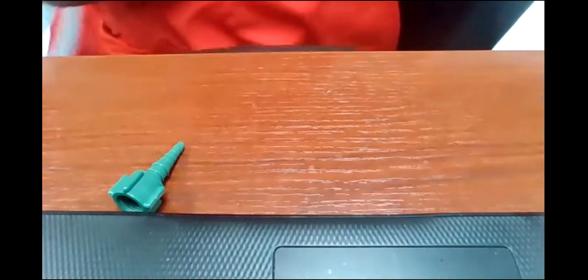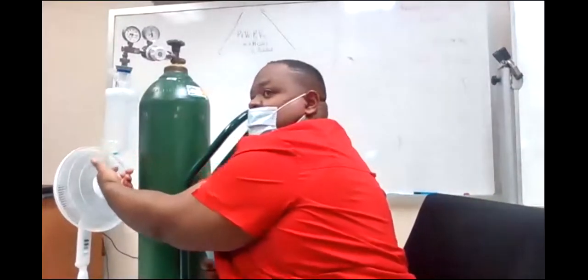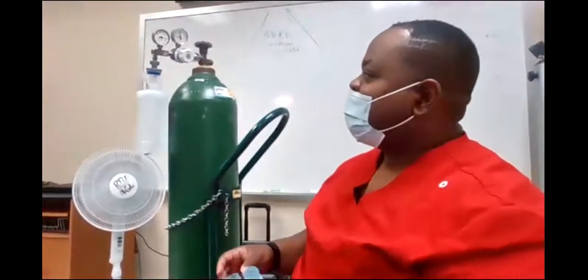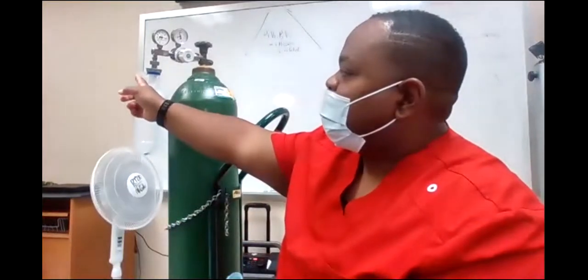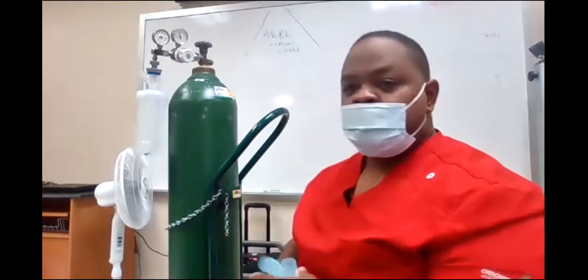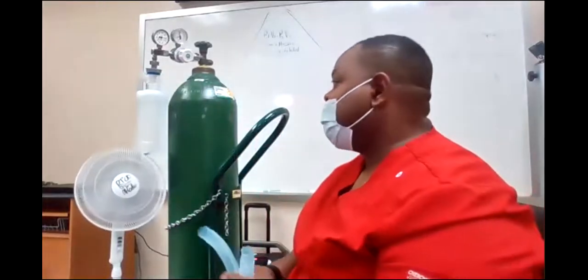See that? You might not can see it at home, but you see that coming out of there? You don't see that mist shooting out of there? You gotta kind of look at something dark behind it. See it? That's aerosol coming out of there. If you can't see it at home, this is aerosol coming. It's like a little fine smoke coming out of there, okay?